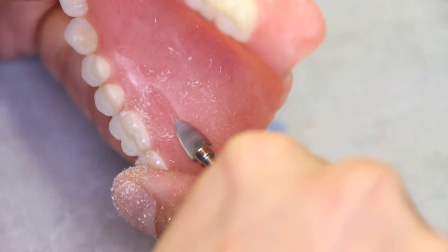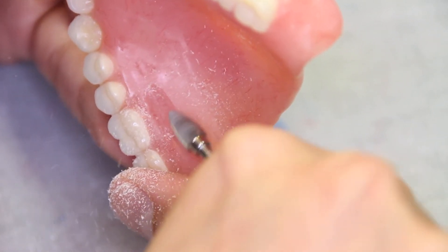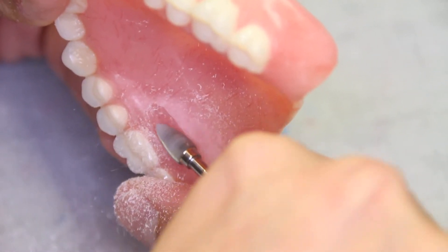It should be noted that with technological advances, we now have the capability of inserting barcodes or microchips inside of dentures. This allows applications on your cell phone to scan or track the location of the denture.